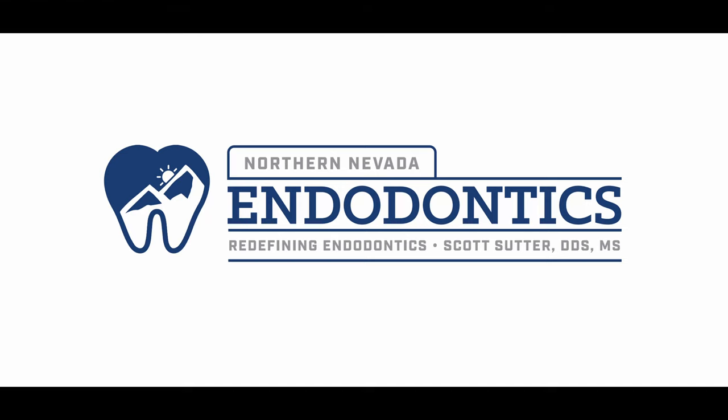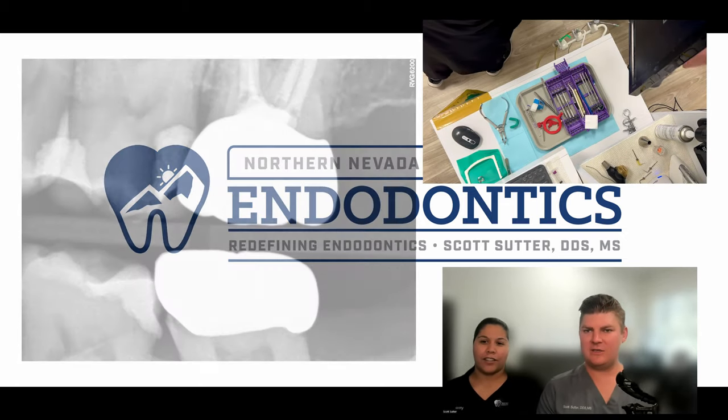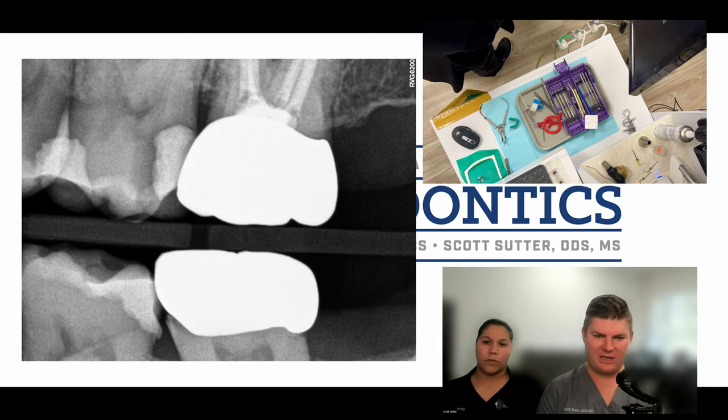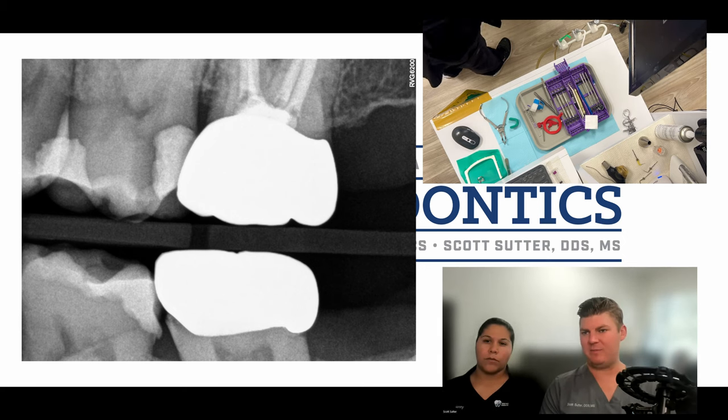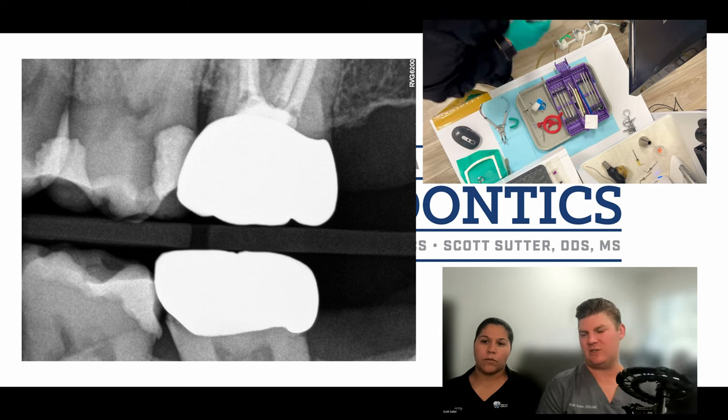Hello everyone and welcome back. We have Jenny here and we are going to show how we're able to do things from a more efficient standpoint. This is the tooth we're working on — number 14. You can see deep caries, patient's in pain, and at this point we've already got the patient numb and Jenny's about to test the tooth and talk through what she's doing.